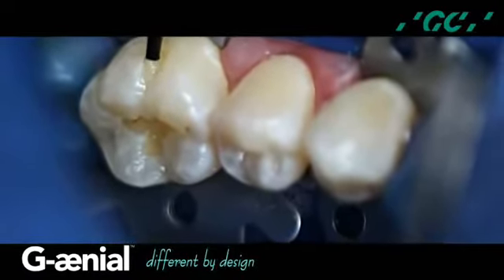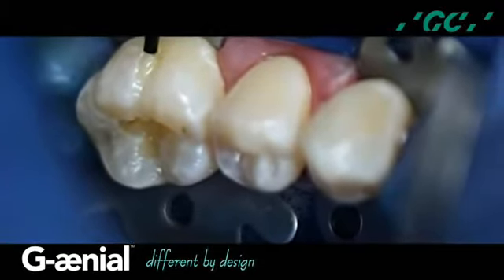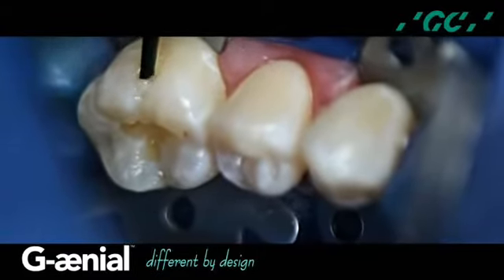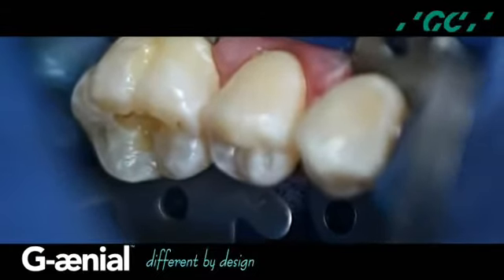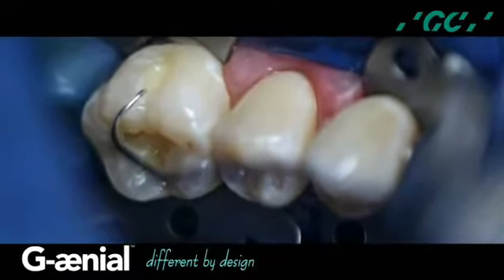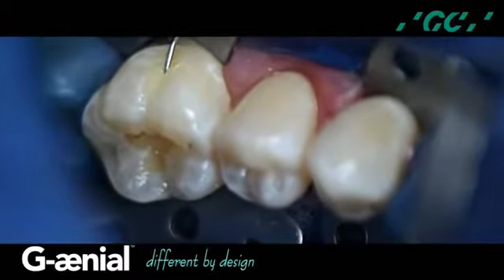Notice the sculptability and the thixotrophic property of this material. Thixotrophy is a structural breakdown of a material, so it flows when the material is stressed, and when the hydrogen bonding restructures, it becomes more viscous. I call it controlled fluidity. Studies by Yamazaki, Chi, and Felix indicate incremental restorative techniques are effective in improving marginal sealing.